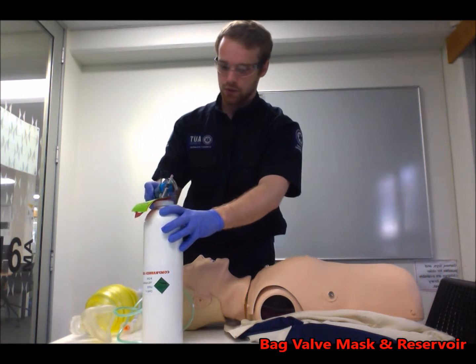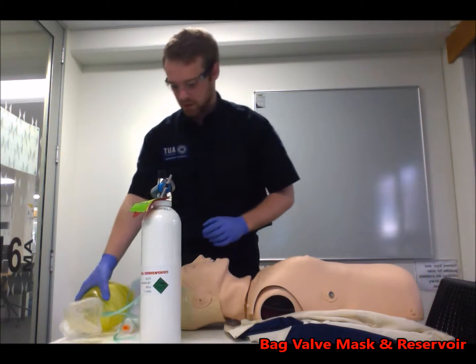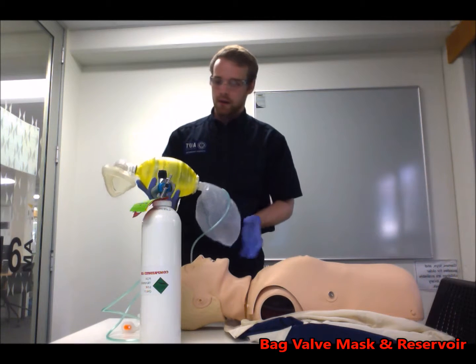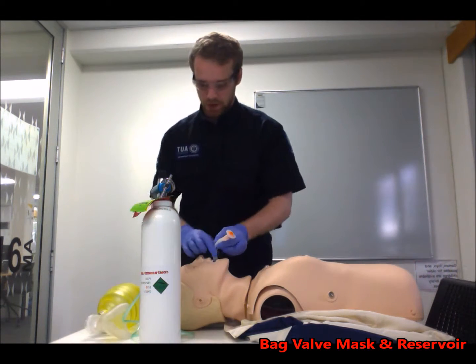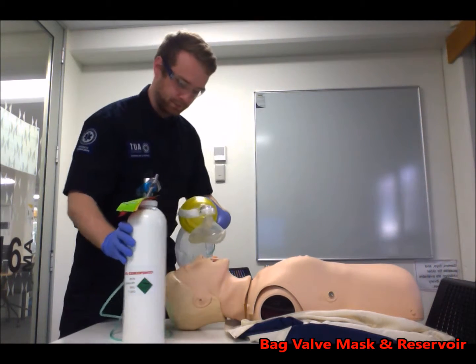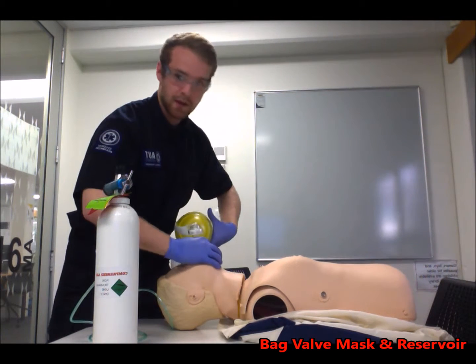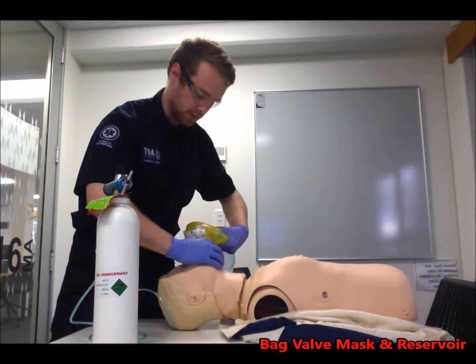And we're going to set this to 10 litres per minute, making sure that the reservoir fills adequately. Next we want to insert an OPA into the patient. From the head of the patient we want to place the bag mask over the top using a C-grip and ventilate the patient every 5 to 8 seconds.